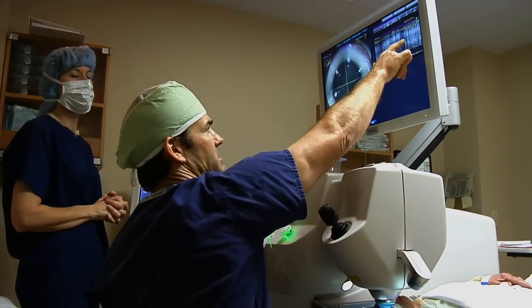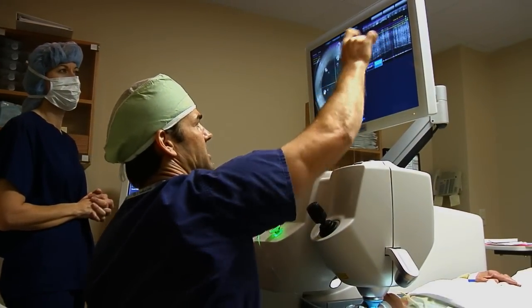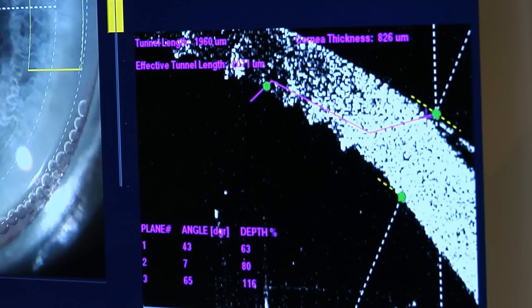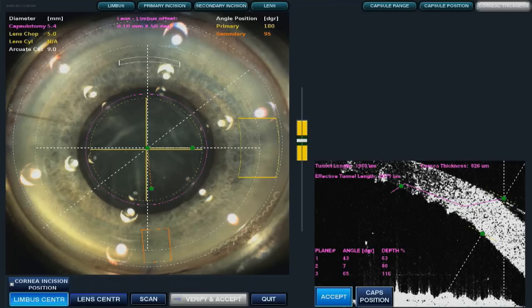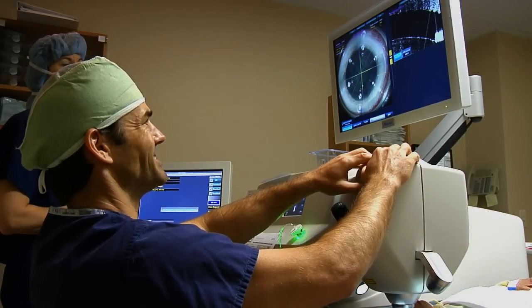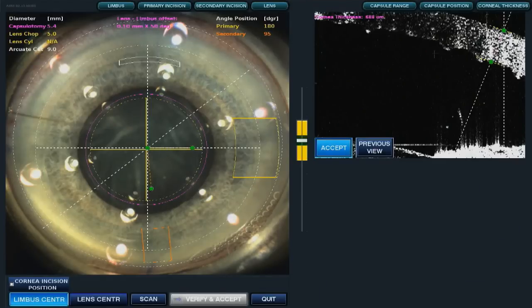This is the bottom of the lens, this is the actual lens, and this is the anterior surface of the lens. So we're looking at the lens thickness here, making sure our treatment is well within it — and of course it is. This is the wound. This is what allows us to have a wound without sutures — it's a stepped wound that comes down to a plane. The laser cuts this exact wound right here. The safety benefit is that this is the thickness of the cornea exactly where the relaxing incision is going. So instead of taking pre-measurements and hoping the blade is the right depth, this is using real-time measurements to make its decision.